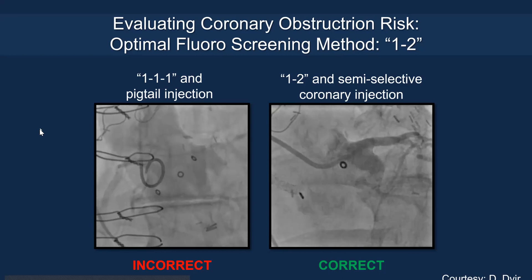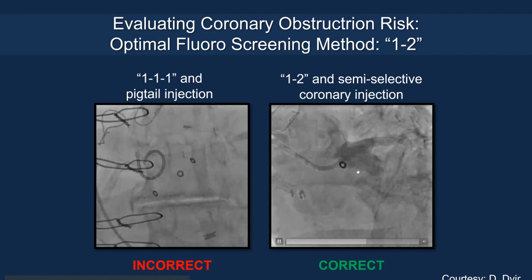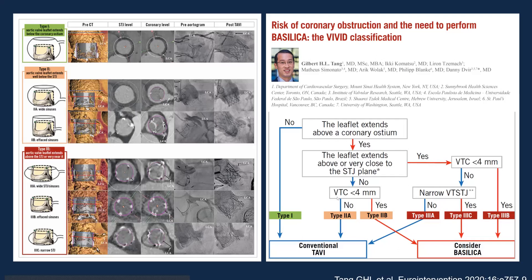Turning to coronary obstruction in valve-in-valve TAVR, evaluation involves 1-2 semi-selective coronary angiography to confirm absolute coronary clearance relative to the commissural posts and displaced leaflets. On the left-side fluoroscopic view, there is good room to engage the coronary, so valve displacement will not cause obstruction. However, on the right-sided fluoroscopic view, the STJ is very small, meaning the leaflets will be close to the STJ and seal the aortic root — posing a higher risk of coronary obstruction. Leaflet management strategy depends on aortic root morphology: if the leaflet extends above the coronaries — especially above the sinotubular junction — at least 4 mm of clearance is required.